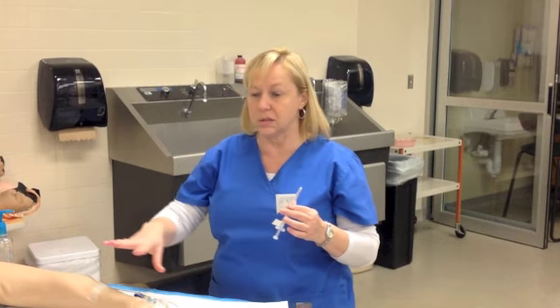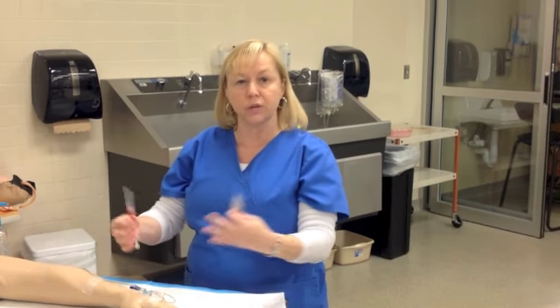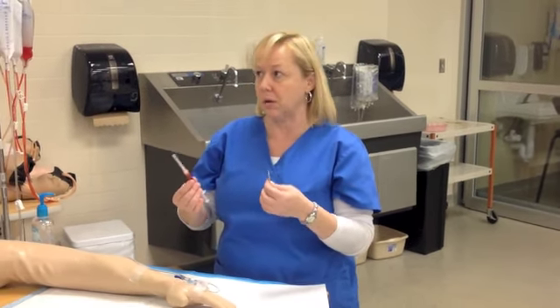We don't have to wear gloves for this procedure because this is a closed system. I'm going to take this needle off and screw it onto this port. Therefore, there's not a big chance that I'm going to become contaminated with blood or body fluids. So that gives me better dexterity without my gloves on.